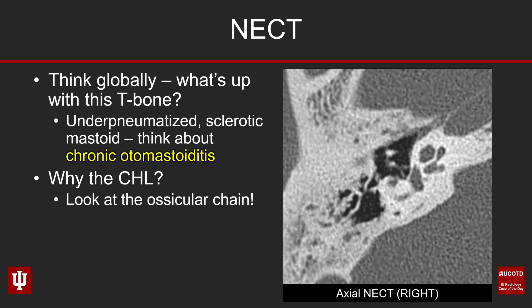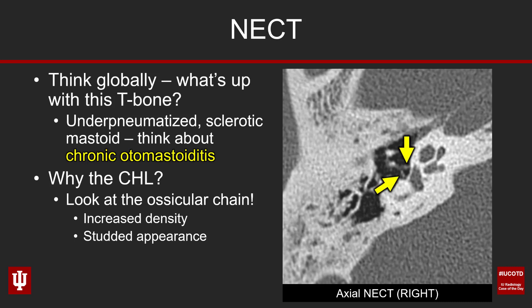Now take a look at the ossicular chain. We see the long process of the malleus, down into the lenticular process of the incus, and the anterior and posterior crura of the stapes. When you look at this ossicular chain, it's too dense, and in fact that density has a bit of a studded appearance. Look at the anterior and posterior crura of the stapes — you can see these tiny dots of increased density. As Rick Wiggins likes to say, this patient looks like they have sprinkles on their ice cream cone. Now let's look at the long process of the incus transitioning into the lenticular process: it's too dense, thickened, a bit smudgy, and surrounding it there may be just a little bit of inflammatory soft tissue as well.